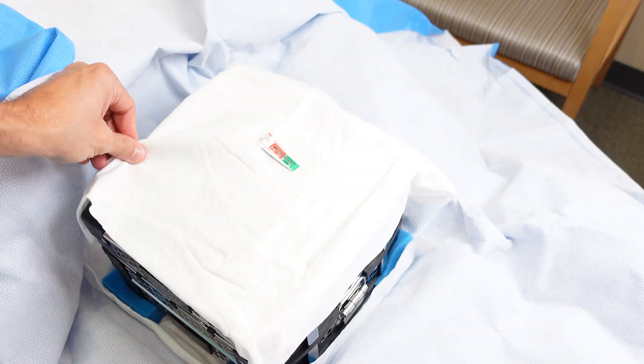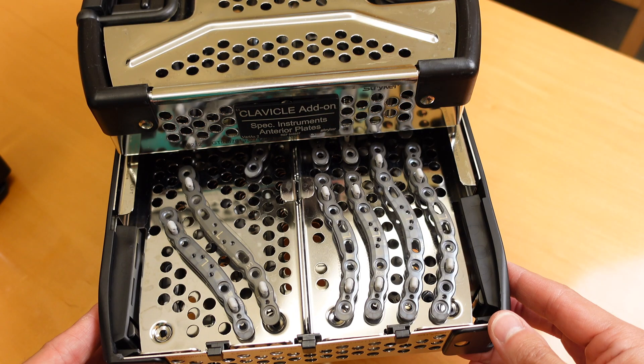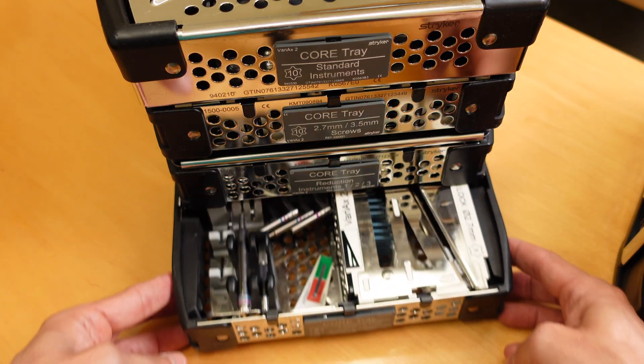The sets are sterilized and compact, ready to go. They are delivered to the operative field where they are opened. When we open the set, you can see how everything comes packaged and has its place — the plates, the screws, the drill bits, drill guides, etc.